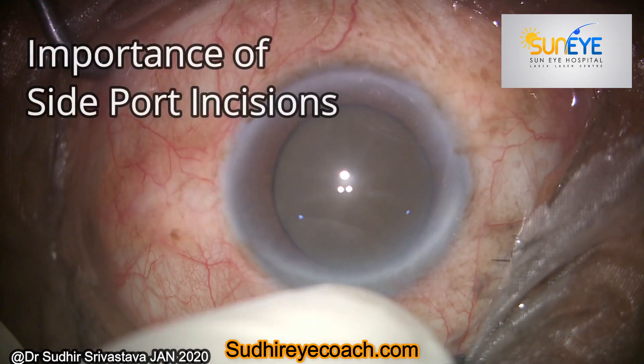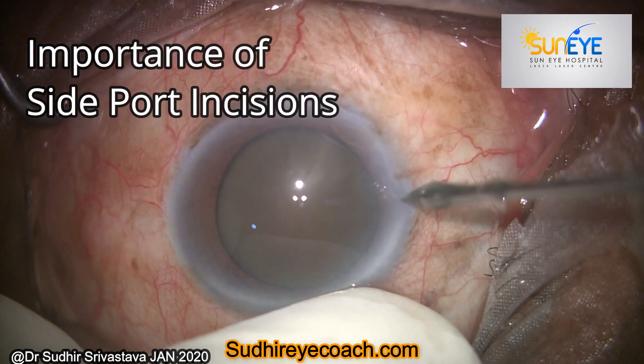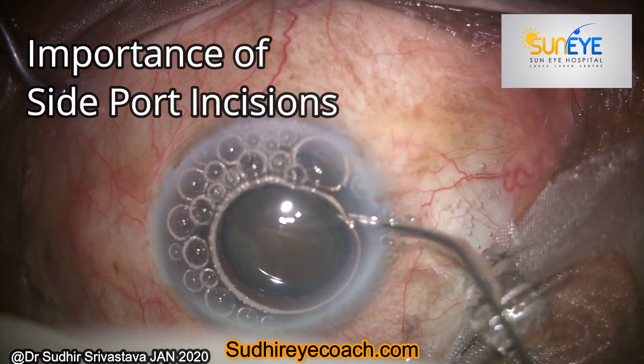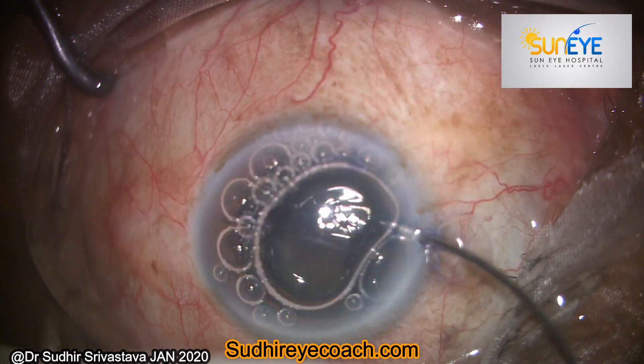Hello everyone, today I'll be sharing a video showing the importance of a good side port incision. Normally I make two side port incisions: one for my rhexis and a second for my second instrument, and normally I prefer 20 gauge MVR blade.